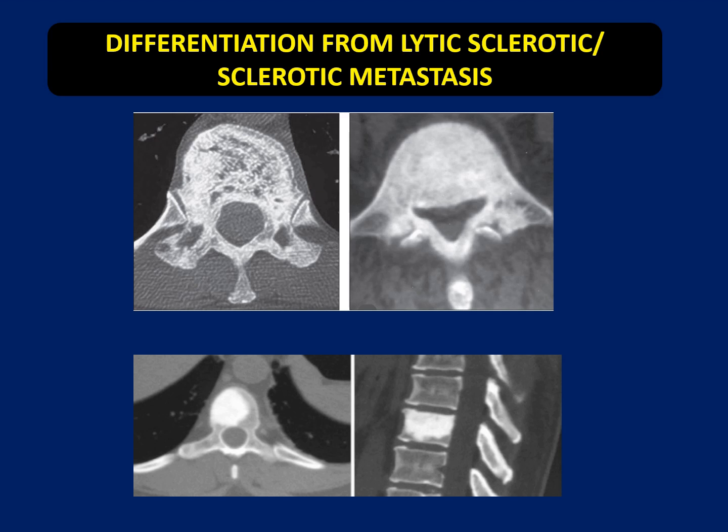So far, what we saw were the important things that a typical postgraduate needs to know during our exams. It still keeps coming in spotters. But practically, when we have a case, the most important thing is the differentiation of Paget's from lytic sclerotic metastasis. As discussed earlier, if there is cortical thickening and expansion, these are the two important things. If these two are present, definitely Paget's disease can be differentiated from sclerotic mets.